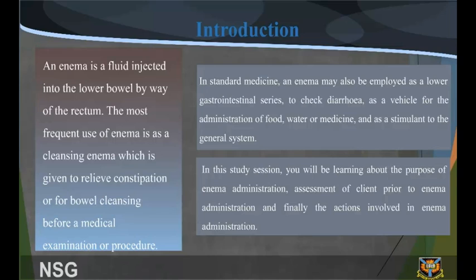In standard medicine, an enema may also be employed as a lower gastrointestinal series to check diarrhea, as a vehicle for administration of food, water or medicine, and as a stimulant to the general system. In this study session, you'll be learning about the purpose of enema administration, assessments of clients prior to enema administration, and finally the actions involved in enema administration.